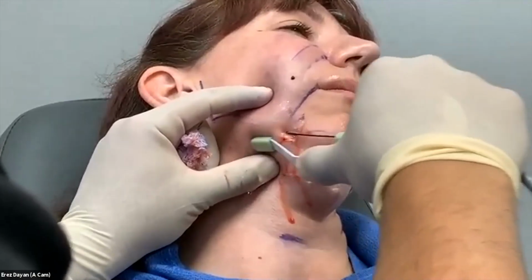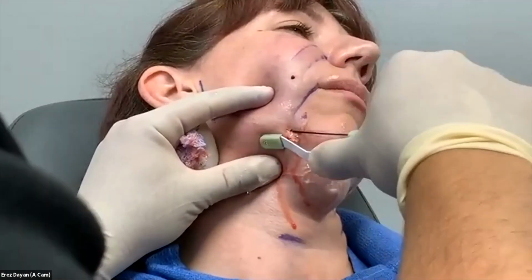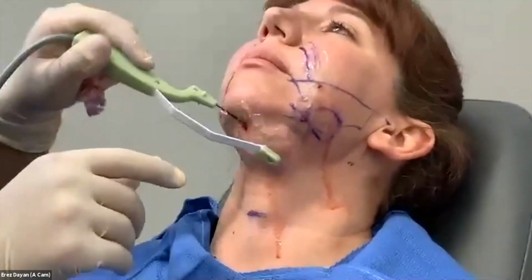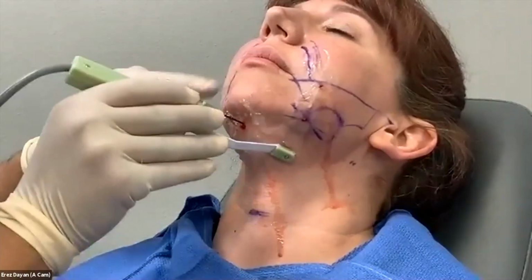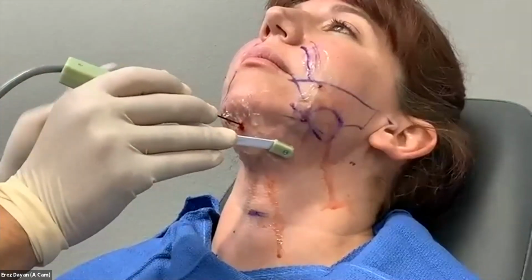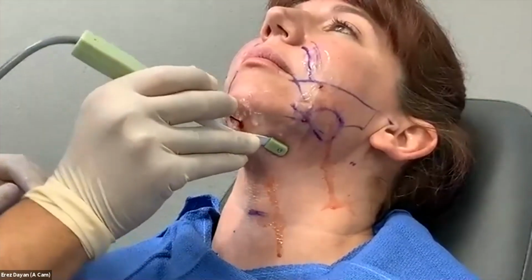You feeling pretty good? Mm-hmm. So that's external temperature we hit just now. Again, here the tendency is to go straight up, but you'd be pretty superficial here if I do that. So I really want to kind of be very cognizant, cantilever down. I have a lot of space because that tumescent just really put the platysma down and everything else up, so I'm good. That's why I like to tumesce a lot. So I'm really holding it down.